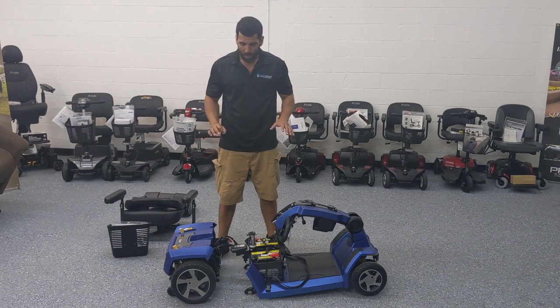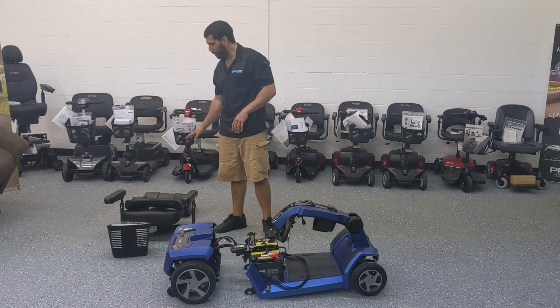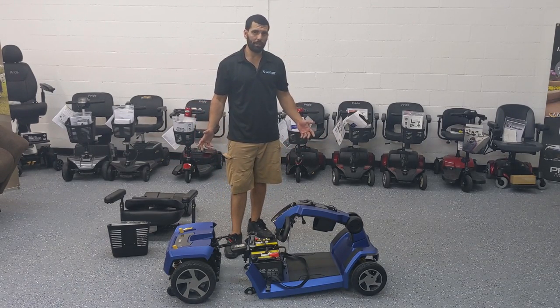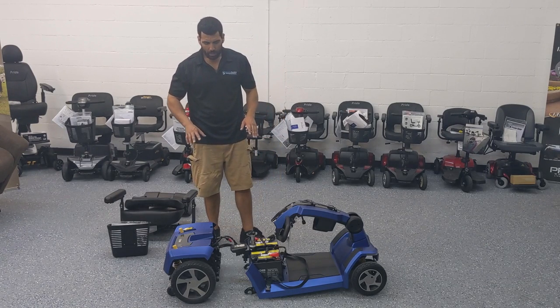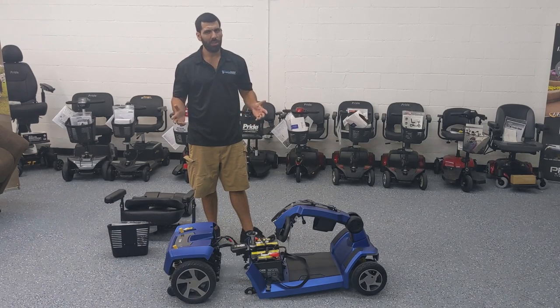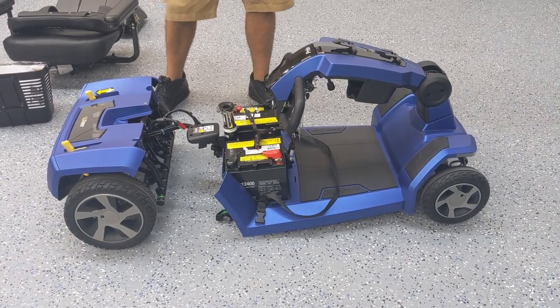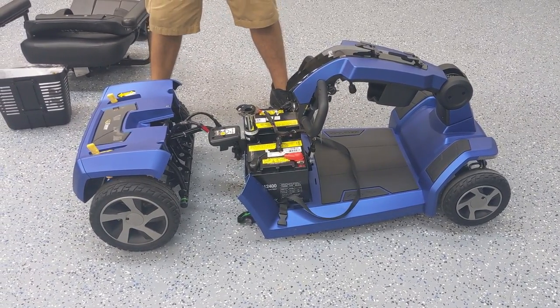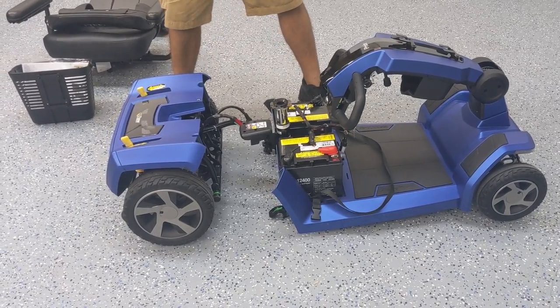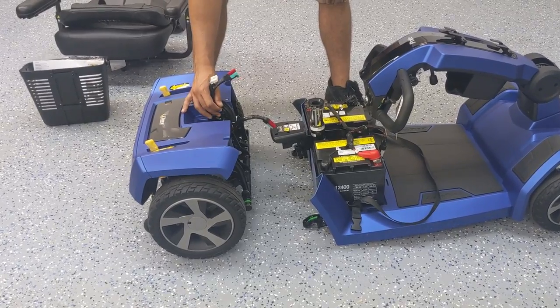Now that we've got the scooter disassembled — with the seat, battery cover, and basket all apart — the only other thing left to do is remove the batteries, which we won't show in this video. Let's zoom in to show you the connections in case you do want to take them out; you just need a few very common tools. I want to give you an up-close shot of how to take it apart and put it back together, since getting up close is really going to show you what's involved.